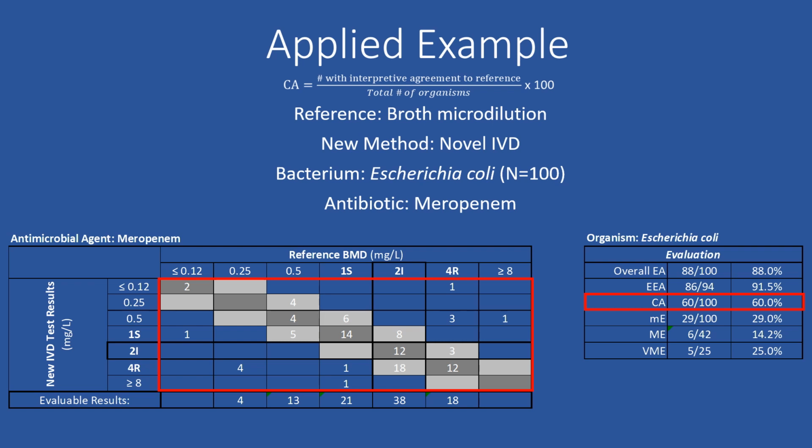This can be explained by numerous variables such as human error and shifts in microbial phenotypic behavior. Researchers have actually found that certain bacteria such as Acinetobacter baumannii exhibit a phenomenon termed phenotypic switch, which can result in bacterial cells switching the appearance of the cell, such as white colonies to opaque colonies, or between avirulent to virulent. Other things to consider are inconsistent expression of antibiotic resistance genes, and a phenomenon termed the inoculum effect, and so much more.